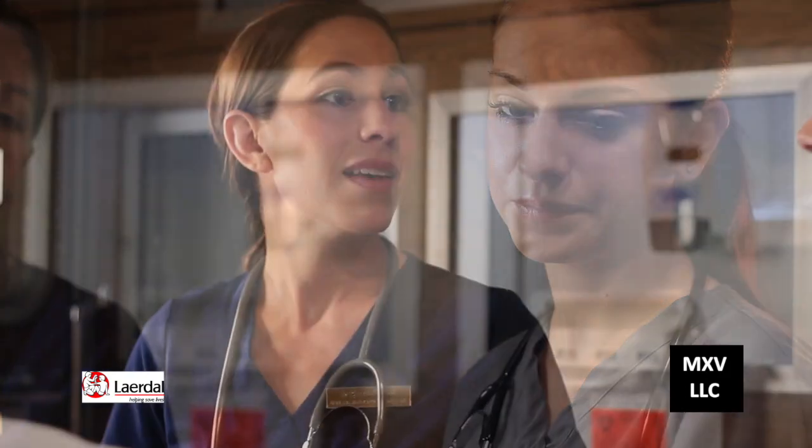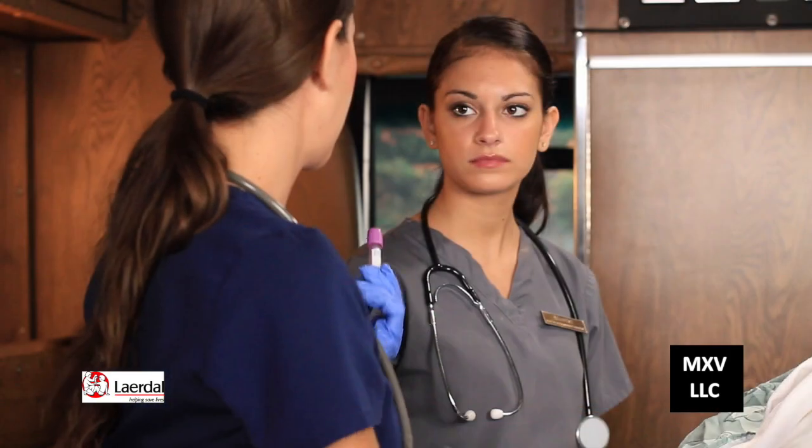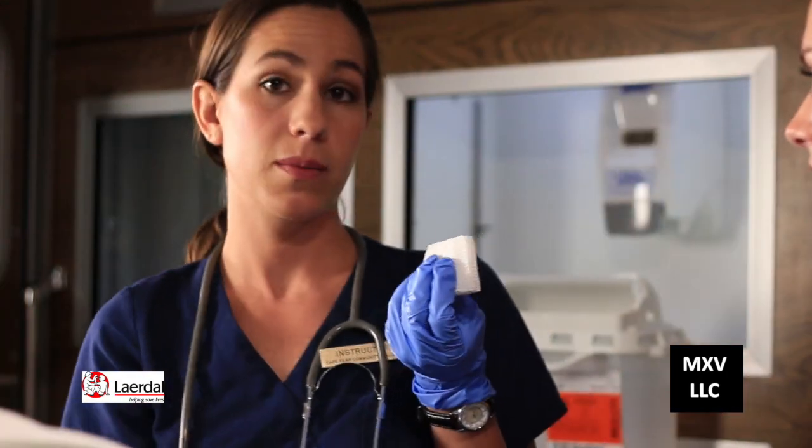Hi, Mr. Marlboro. My name's Holly and this is my instructor Rebecca, and we are going to be drawing your blood today. Some of the tools that we need today are a tourniquet, vacutainer for the blood, and the needle, and some alcohol, and some gauze and some tape for when we're done drawing the blood.